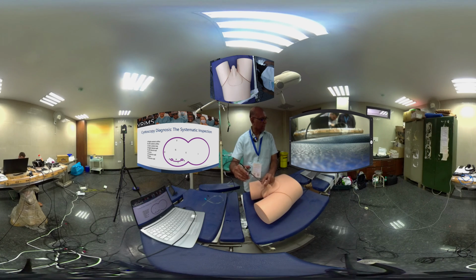So, once you reach the bladder, you look at the bladder neck and the interureteric ridge, and then the two ureteric orifices, which is simulated here, and then you can have a look at the dome. You can turn the scope and press the bladder to have a look at the dome, then the 9 o'clock position and 3 o'clock position.